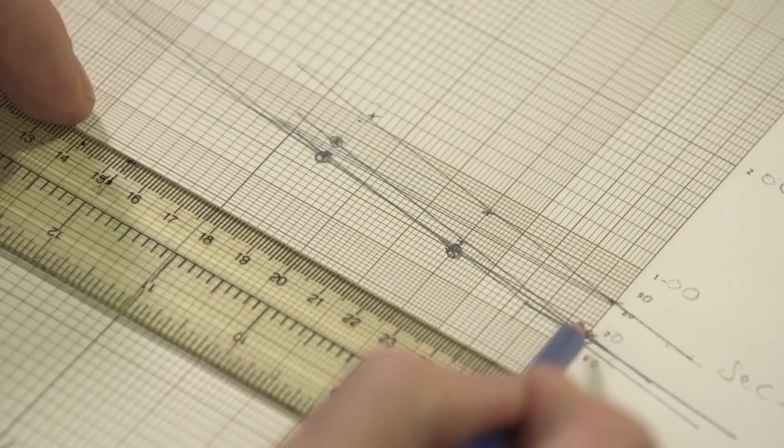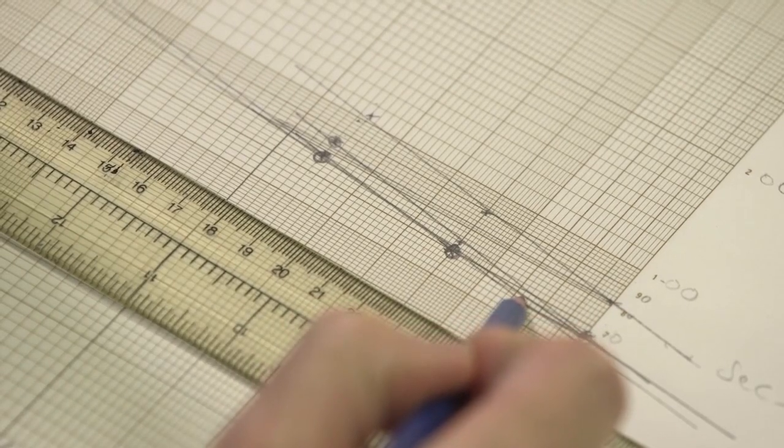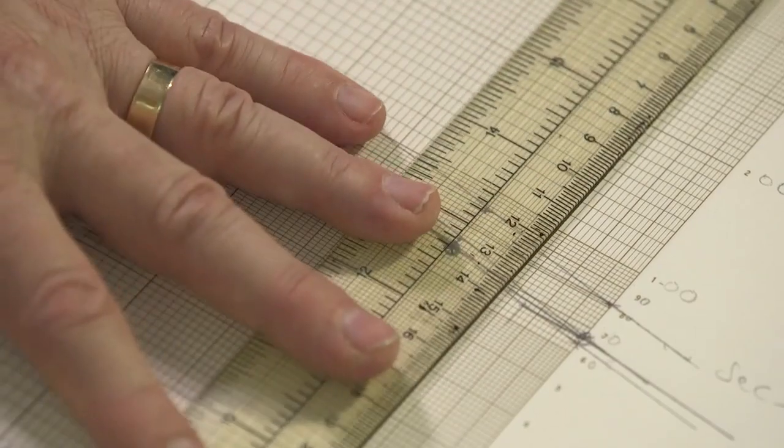Let's suppose we'd made just a single test dilution, the 1 in 10. That would be the normal practice in centres doing a single test dilution. Remember, the clotting time was 67 seconds. If we only had that point and we looked on the standard line, what is the concentration of standard that would plot at 67 seconds? The answer would have been around 74%. 74% of 94, 69.6, 70 international units per deciliter.